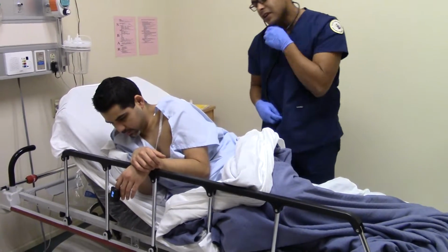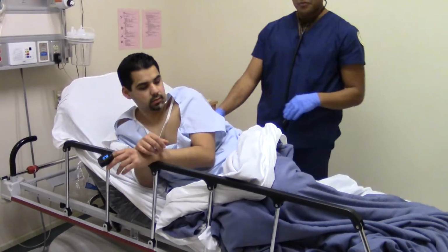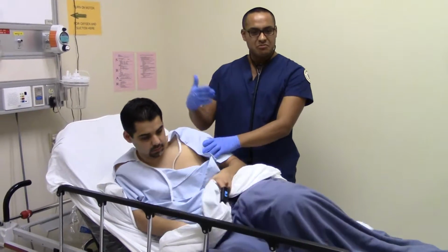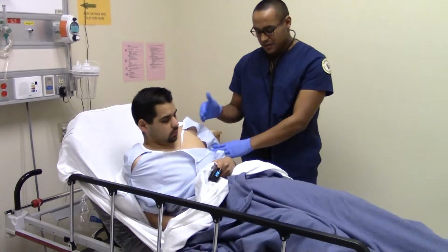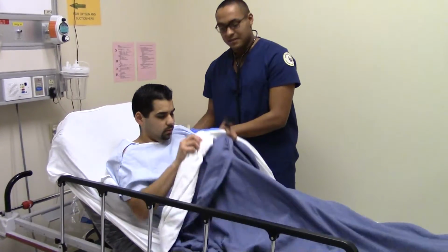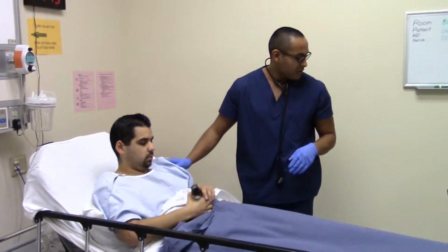You know what? I'm going to be quick. I already heard the wheezing in the left lower lobe. The patient already said he's felt harder breathing. Going to speed it up a little bit. Okay. Left lower lobe wheezing. Alright. Good. Thank you.